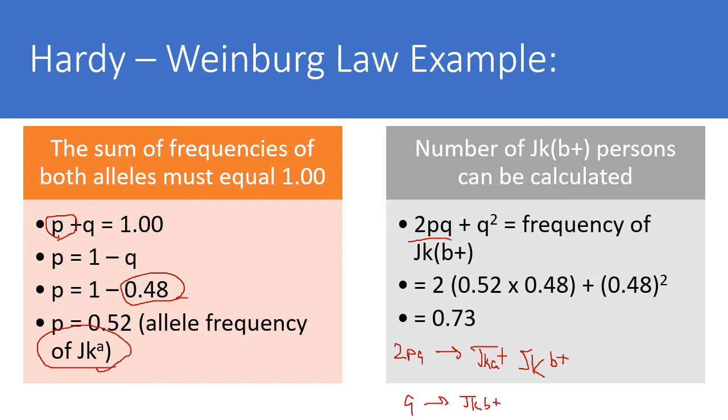When you have parentheses, remember that whenever you have a mathematical equation, you do what's inside the parentheses first. So you do the calculation inside this parentheses first. And the thing about this is that if you don't, you can get the wrong answer.